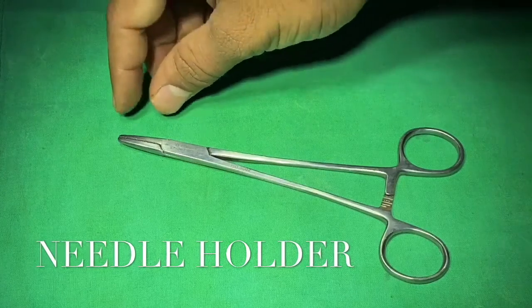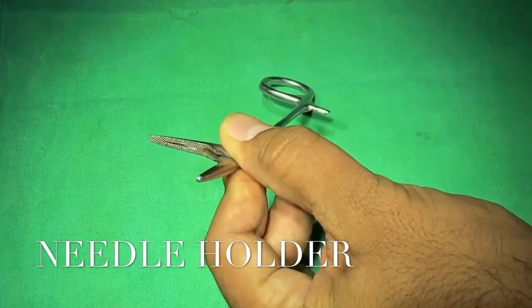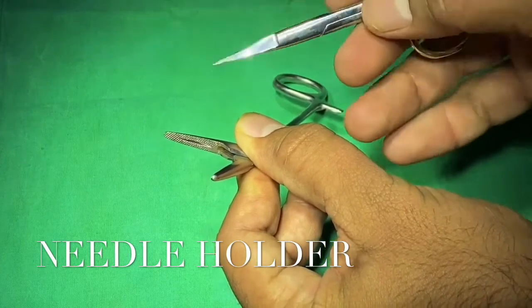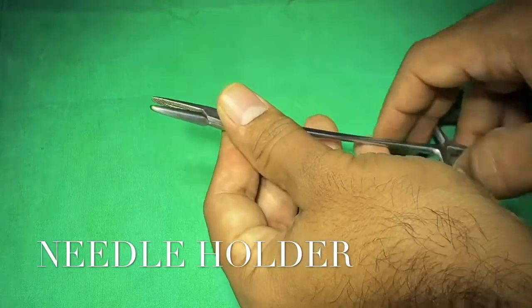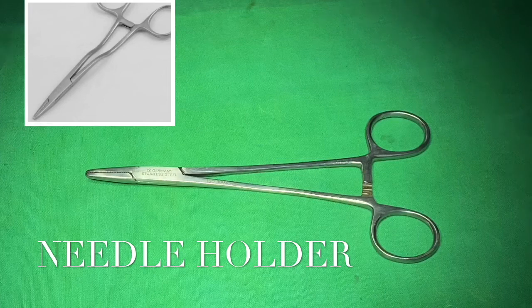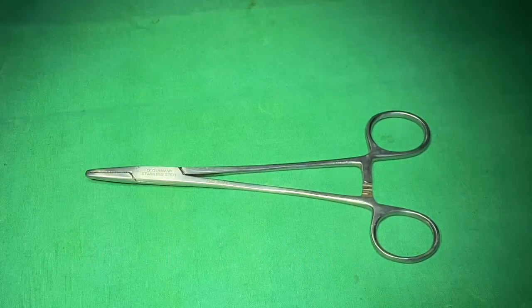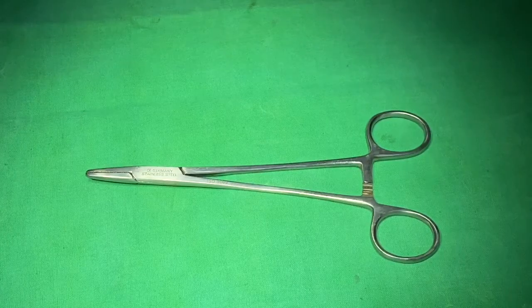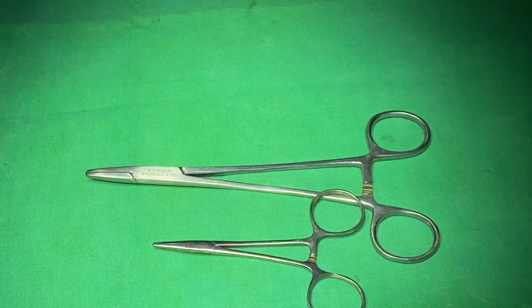This is a needle holder, specifically a Mayo-Hegar needle holder. The jaw has zigzag serrations for proper gripping of the needle, and there is a groove within the jaw to hold a curved needle with proper grip. This is the main difference from a straight artery forceps: shorter jaw length plus serrations and groove. There is also a Kilner needle holder, which is the curved variant. Appropriate needle holder size must be matched to needle size — using a bigger holder on a smaller needle risks damaging the needle, and using a smaller holder on a bigger needle may damage the instrument.